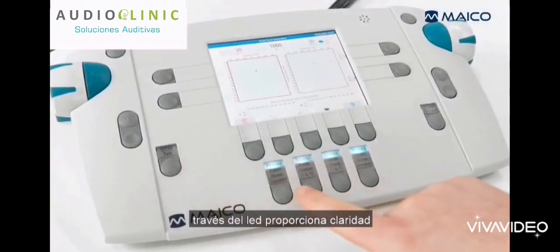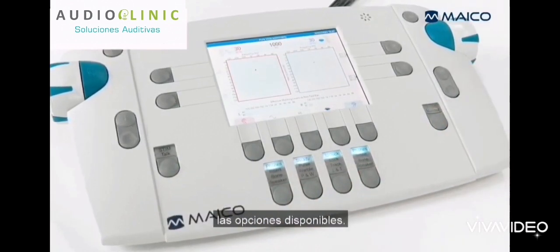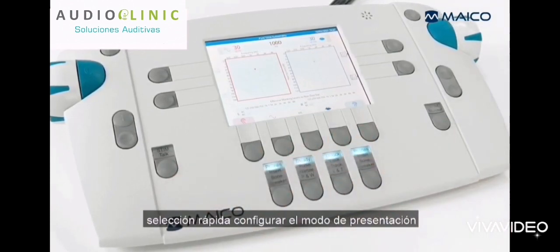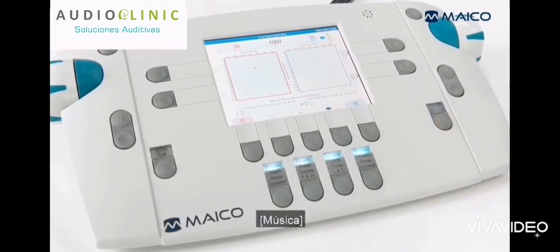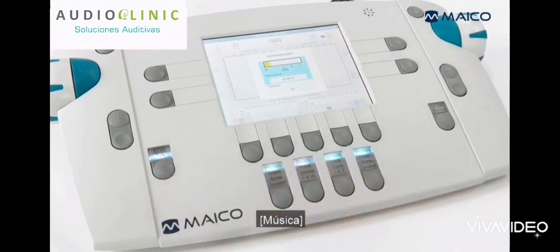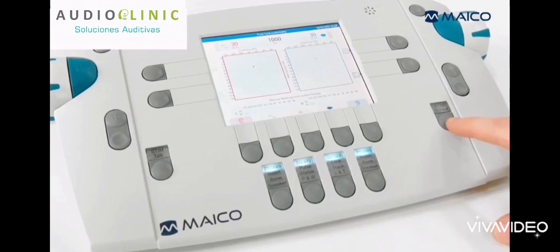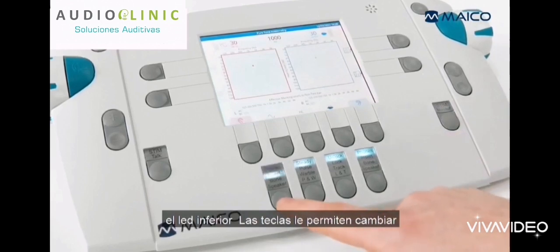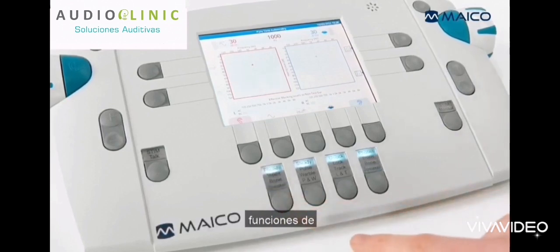For the LED keys, the visible key assignment via LED provides clear identification and gives an overview of the available options. The STIM talk and STIM monitor keys allow a quick selection to set the presentation mode — interrupter or presenter — and give easy access to talk forward, talk back, and monitor functions. The lower LED keys allow you to change the transducer, set the signal type for the tone tests, and use the lock and track functions.